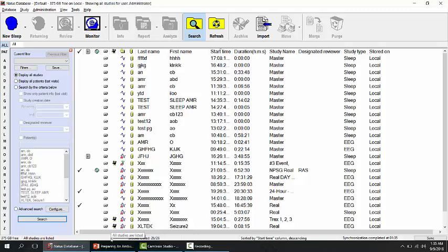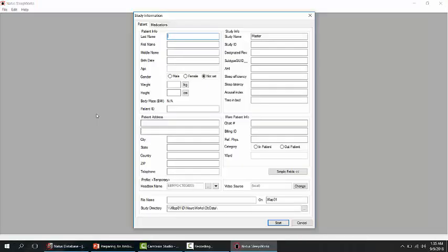In the NATUS database, click the arrow to the right of the New button and choose Sleep from the drop-down list. The study information window pops up. Enter patient demographic information in the Last Name and First Name boxes.